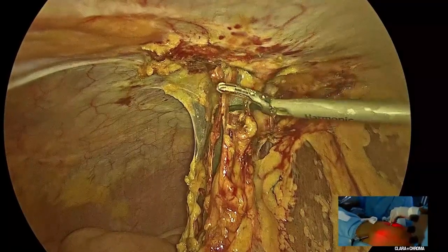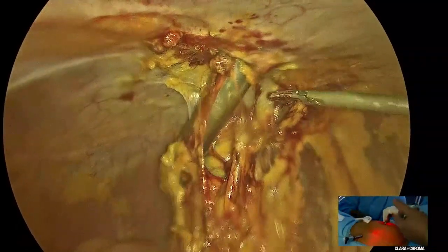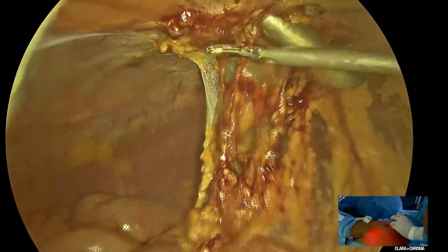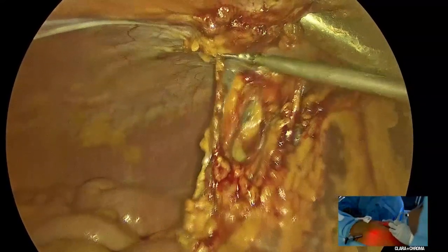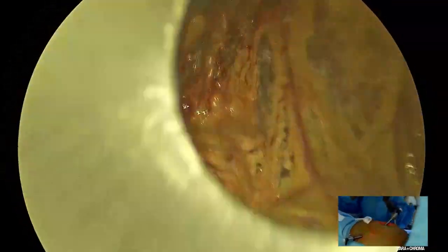I thought that we'll carry on with discussion when you do adhesiolysis. Please go ahead. Which approach do you follow normally for right hemicolectomy? There is the medial approach, the inferior approach, the anterior approach and then the lateral to medial approach. Correct. Compared in terms of oncological clearance, which approach do you follow normally? Clean the camera.